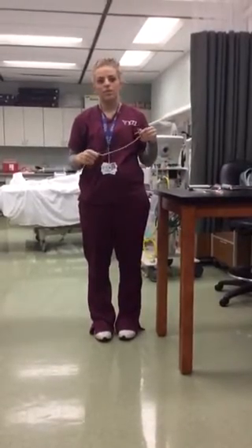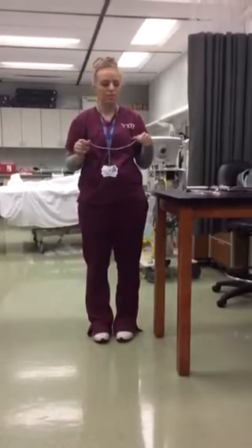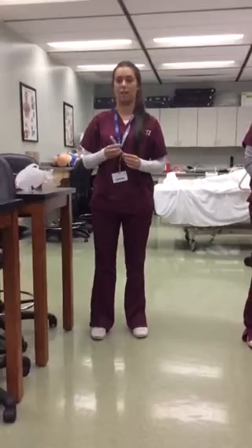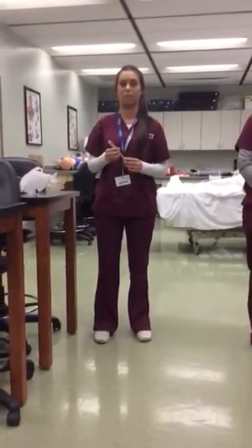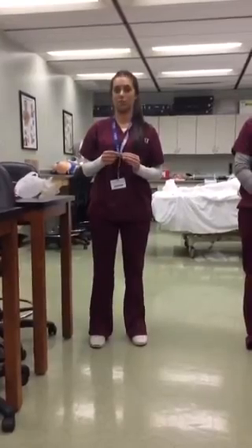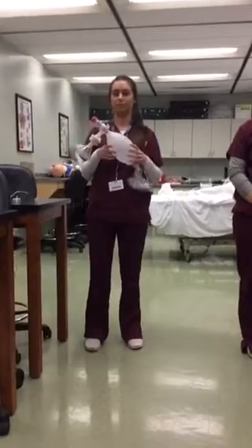This is known as a stylet, which is a device that is rigid that goes inside the ET tube for easier insertion. This is the syringe. It inflates and deflates the cuff. The average size is 10 to 12 milliliters syringe. This is the capnometry device. It's a disposable CO2 detector. And this is the bag valve mask used to ventilate the patient.